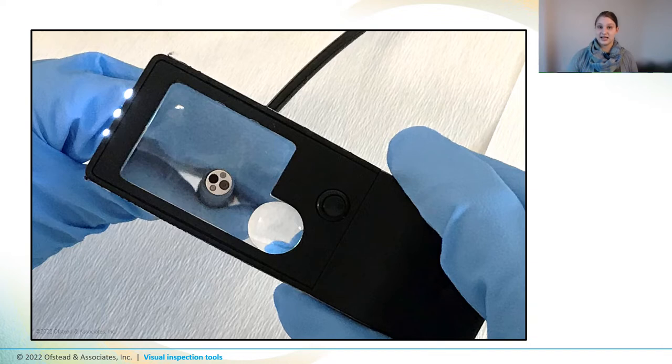Now let's take a closer look at a handheld magnifying glass. This one has different levels of magnification, with the larger rectangular lens offering three times magnification and the smaller round lens offering ten times. It also has built-in LED lights to help you see, and it's really easy to clean and disinfect. Simple magnifying glasses like these can be really helpful for inspecting distal ends and other tiny components.